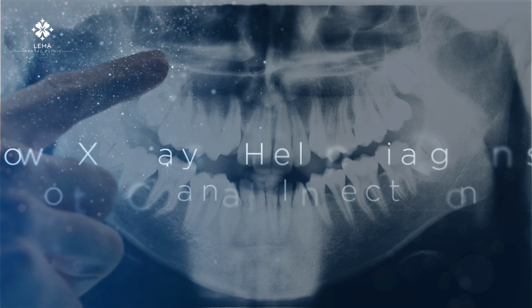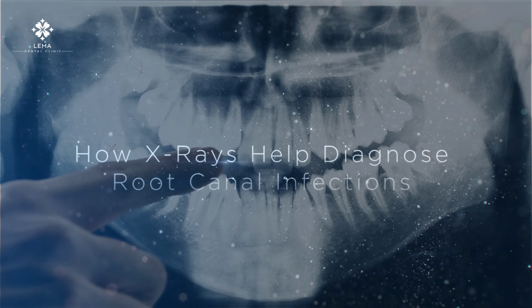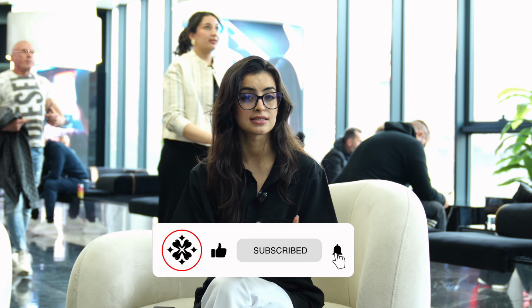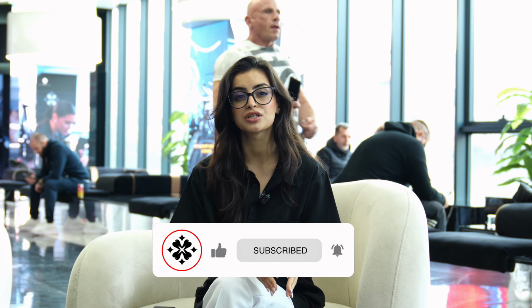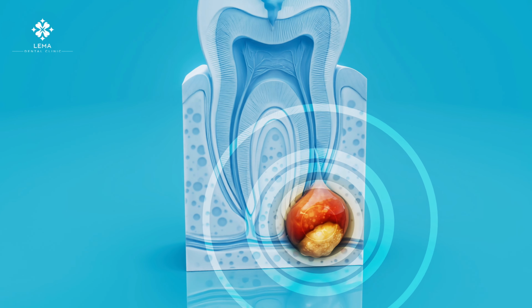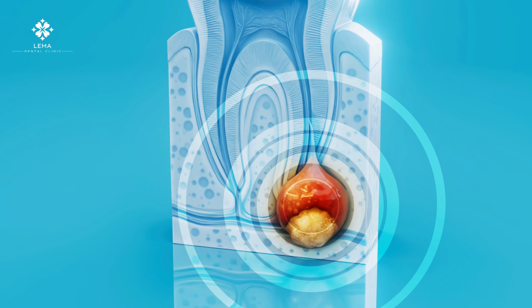How X-rays help diagnose root canal infections. During the initial visit, your dentist will take an X-ray to diagnose the root canal infection. The X-ray helps identify the size and location of the infection, such as whether it's limited to the pulp or has spread to the surrounding bone. This allows the dentist to determine if a root canal is necessary or if there is more severe damage that requires additional treatments. X-rays can also detect abscesses, cysts, and other complications related to infection.